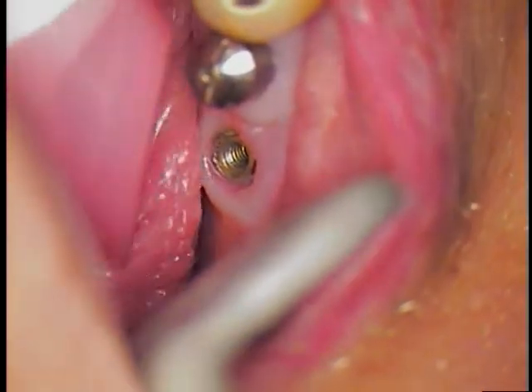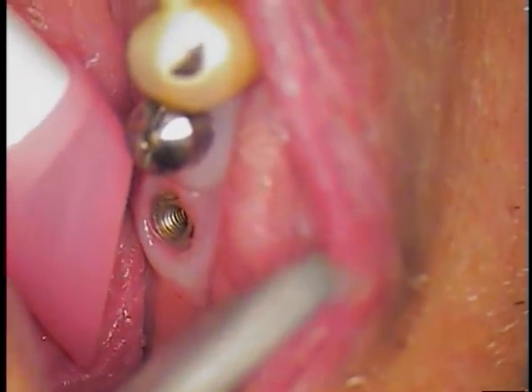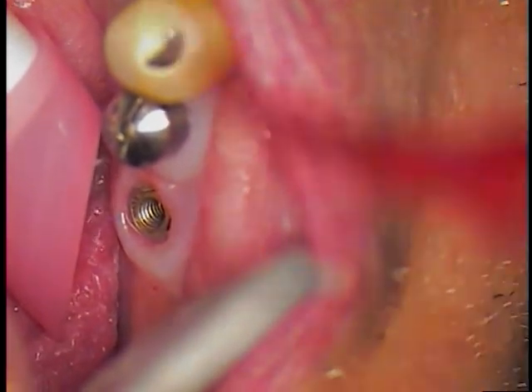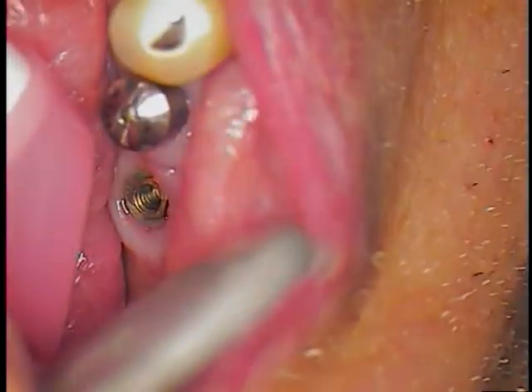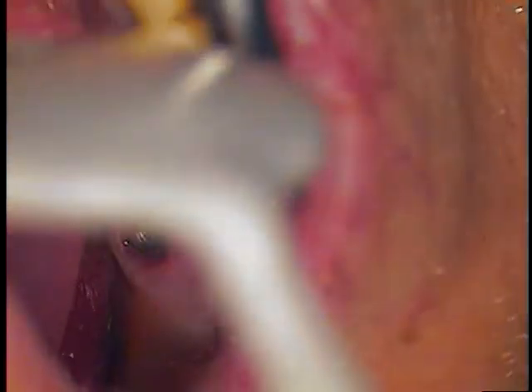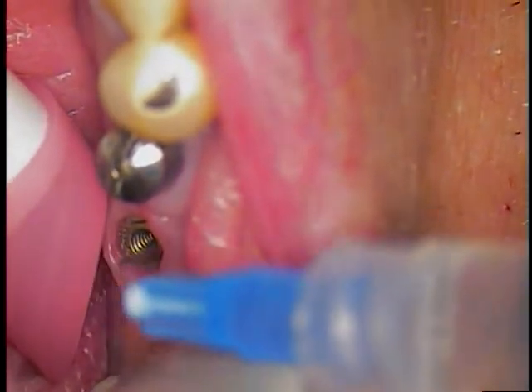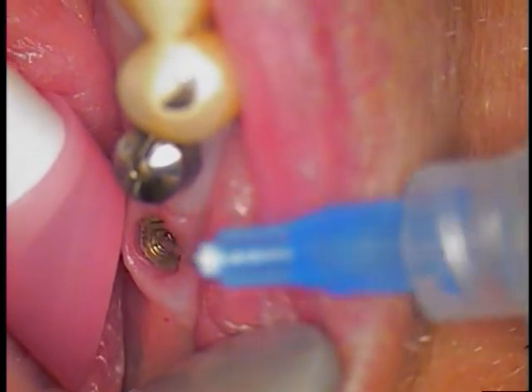Keeping all the parts as we're going to make another order. I'm going to go right down and scrub that with cavity cleanser first. There's Concepsis from Ultradent — just doing that. That tip's not on all the way. That's a big piece of bio-burden coming up.